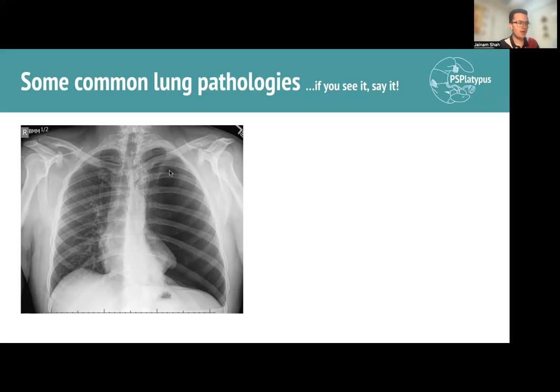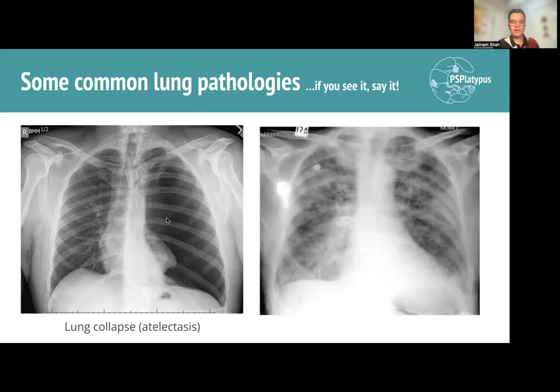So what's happened is the air has filled inside here, it's caused this lung to collapse, and then all of the contralateral mediastinal structures have been pushed even further laterally, okay? So this is very classic of a lung collapse, potentially due to a pneumothorax. Now this image, again, have a pause, just have a think about what's happening here.